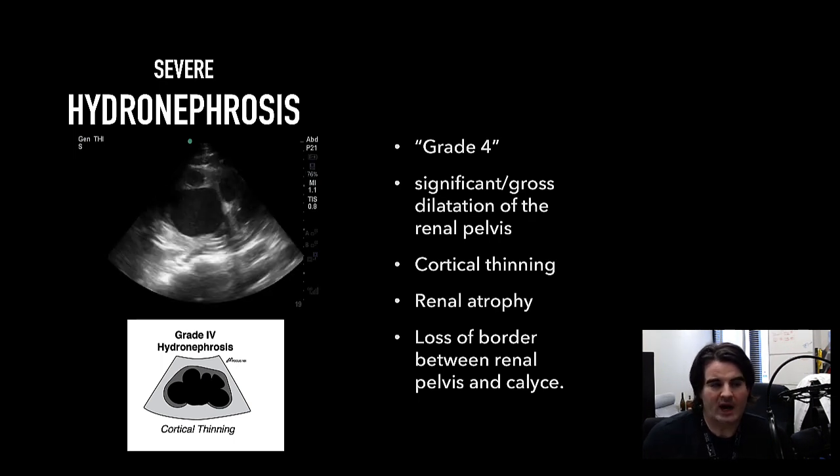I would say be aware of severe polycystic disease, and this can really be a fake out. You should pay attention to whether those anechoic spaces communicate with the renal pelvis. If you see discrepant areas of what looks like preserved anatomy, this might be one telltale sign that, in fact, you're looking at severe cystic disease. So always check. That's certainly a compelling reason to get more comprehensive imaging, or just cross-reference if perhaps CT imaging or ultrasound imaging has been performed before, or there's documentation of polycystic kidney disease. This can be an easy fake out for hydronephrosis to the untrained eye.